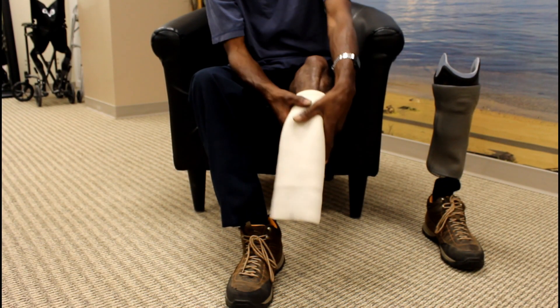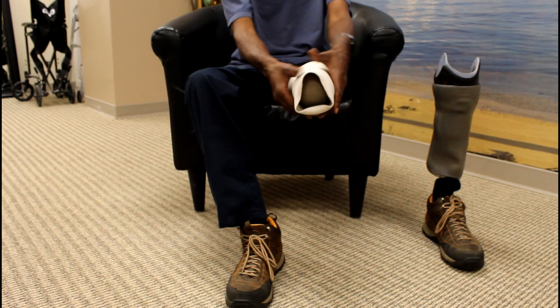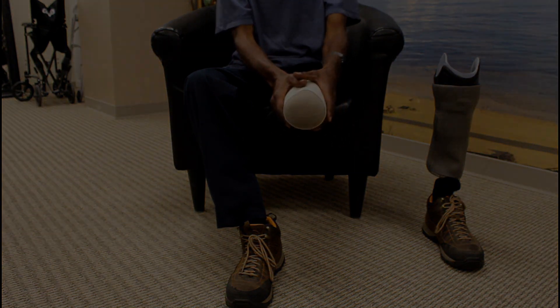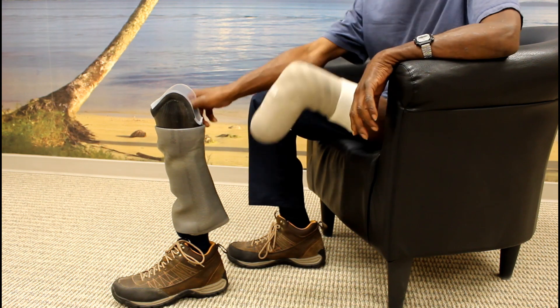To don your transtibial suction prosthesis, put on your gel liner by inverting the liner completely and roll the liner onto your limb. Make sure no air pockets or spaces are left between the liner and your skin. Liners which have fabric must have the top of the liner reflected so that the gel is facing out, as demonstrated here. Fabric will prevent an airtight seal from occurring.